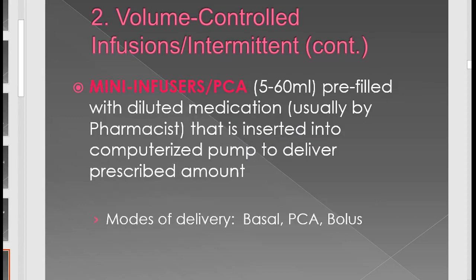If a patient were to have a mini infuser, such as a PCA, this also would run as a tandem. You have to make sure that all tandems or PCAs are compatible with the primary IV fluid that is running.